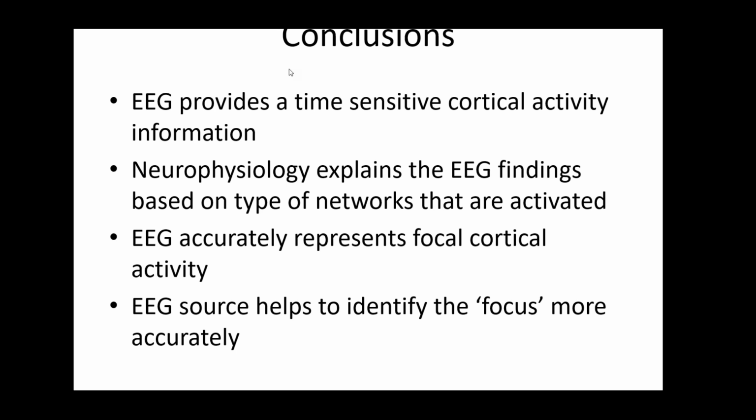All right. All right, one more, then we'll let you off the hook. Can EEG wave analysis be helpful in the diagnosis of attention deficit disorders?